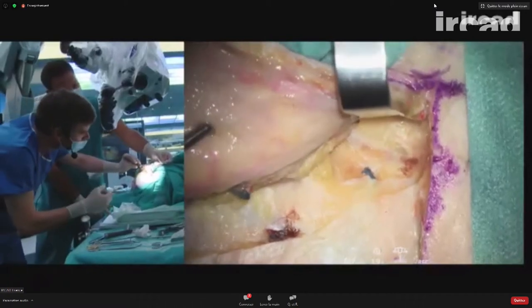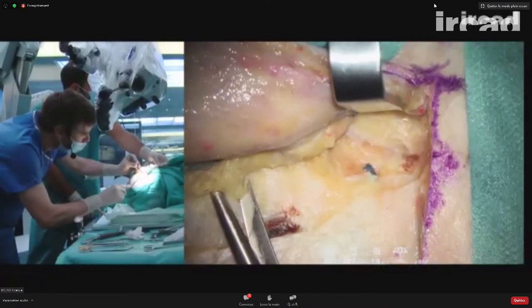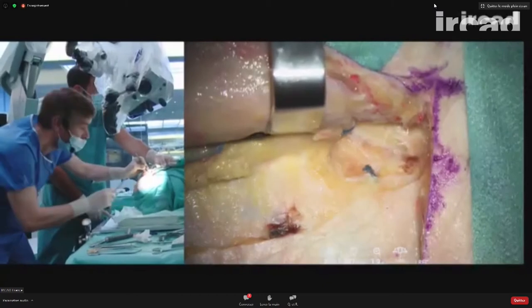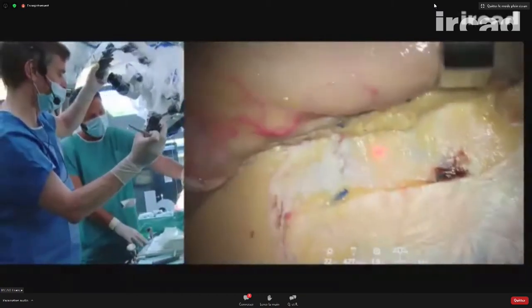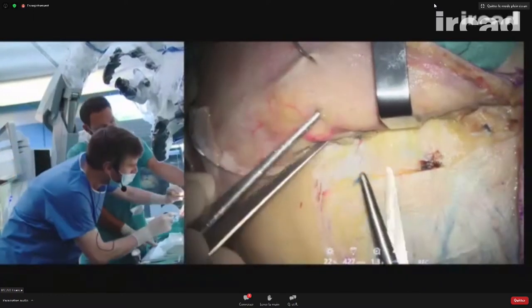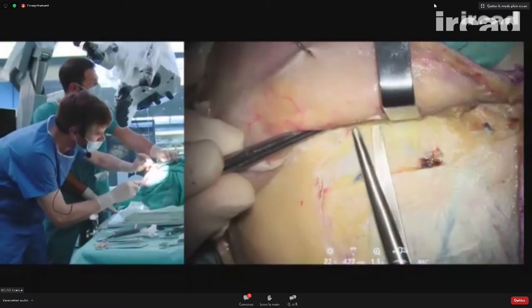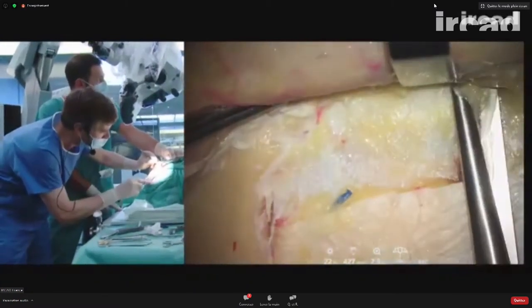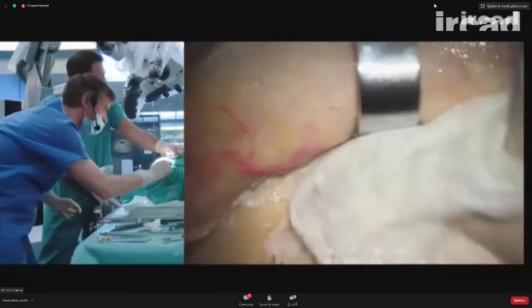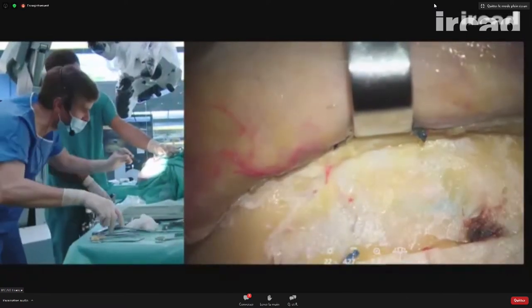Okay. Here also, I can keep going, following the deep fascia. There's always a tiny artery here. We follow the deep fascia anteriorly.